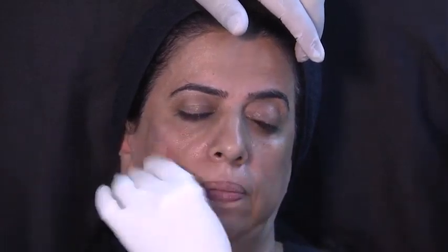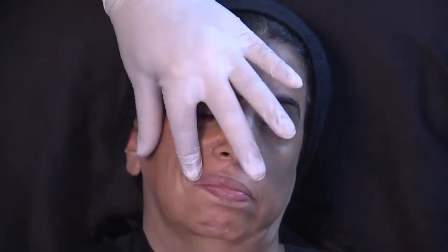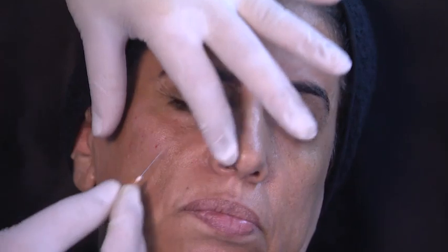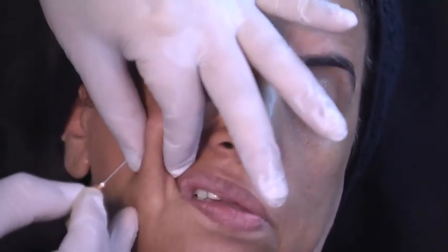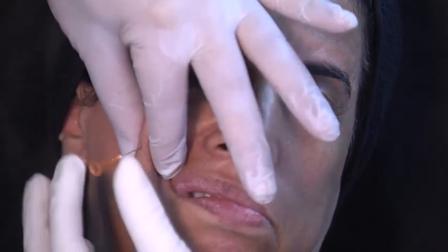And this is how the points look below the superficial fat. I'm putting just... Right. Okay, Juan, you can proceed. So, we have done the lateral part, now I want the medial.